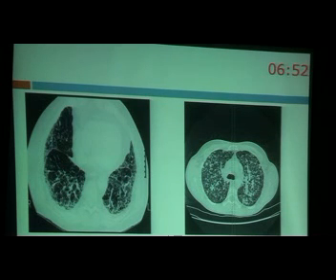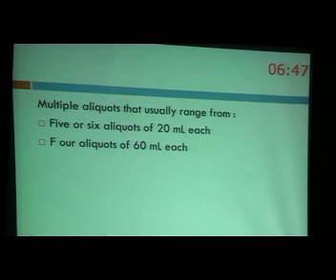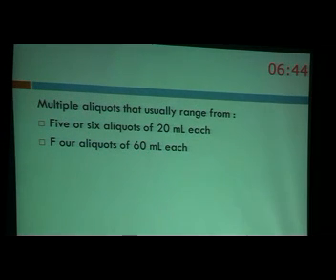لما الاريز اللي فيها activity more or less نبقى احنا expecting ان احنا نجد cells more informative of the underlying disease. نحقن قد ايه؟ الليترشر مختلف جدا انما on the average 150 ml اما بتبقى aliquots of 20 ml او aliquots of 60 ml زي ما قلنا كده just inject with the aspirate. طبعا في بعض الحالات زي البروتينوز بنعمل whole lung لافاج زي ما هنشوف بعد كده انما الافرج 150 ml وبنexpect ان احنا نجيت 60% of this injected fluid depending على الباثولوجي وعلى السيجمنت.